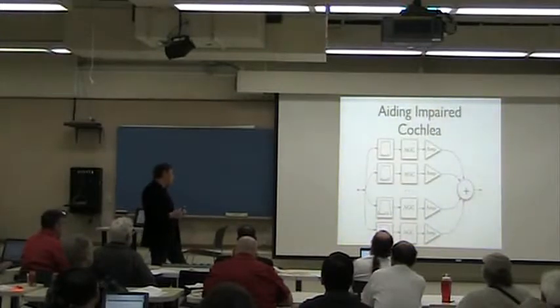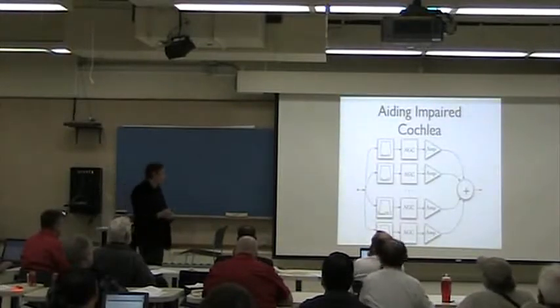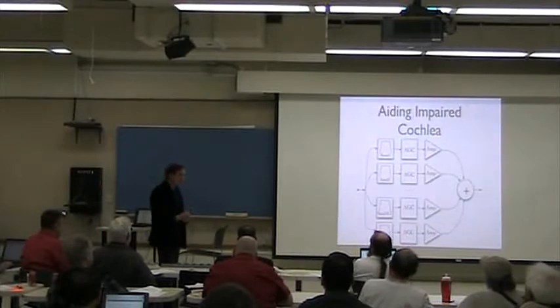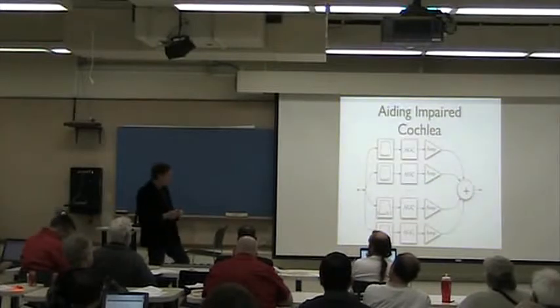But what people do differently is how exactly you implement these components: how many bands you're going to implement, what the algorithm and what the parameters of the automatic gain control you use, things like this.